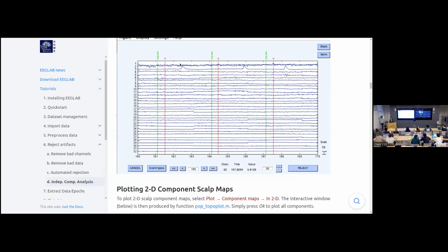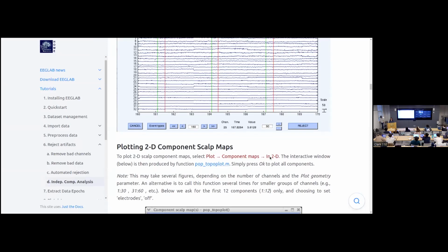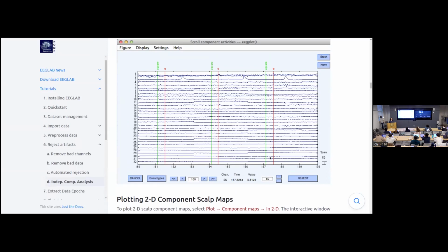Okay, so whenever you see these little spikes, you know that these are not contributed to by your cognitive activity, because they look very distinct from your other channels, right? And PCA is actually not used in processing EEG signal. I know there are examples of PCA, but it's mainly used in processing images.